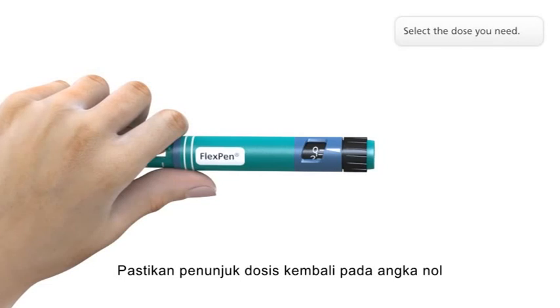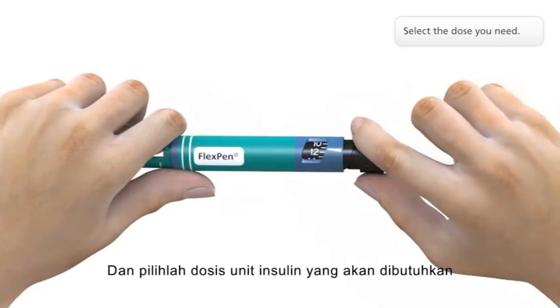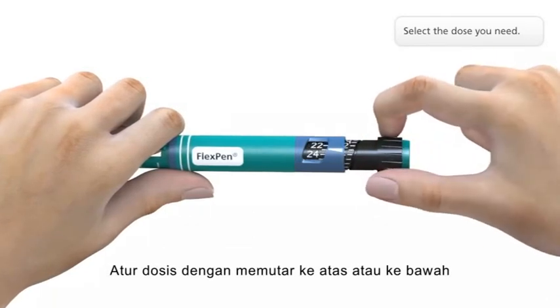Make sure that the dose selector is set at zero and select the number of units you need to inject. Adjust the dose by dialing up or down if necessary.